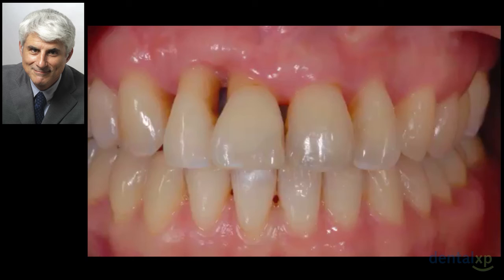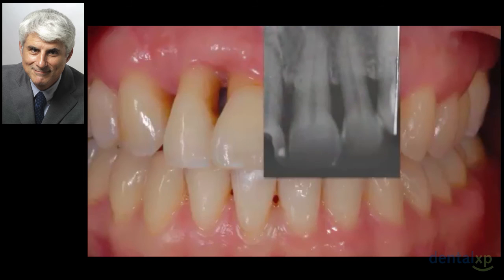She has an early aggressive periodontitis, and she used to see many dentists. Every dentist did something on her, especially on the first quadrant. They did every kind of procedure: osteosurgeries, bone grafting, connective tissue grafting, any kind of mucogingival surgery, and laser therapy as well. The result is this. But on the other side, let's take a look at the X-ray of this case.